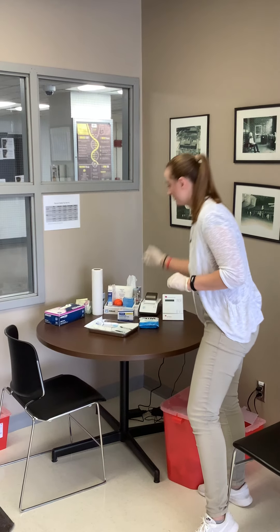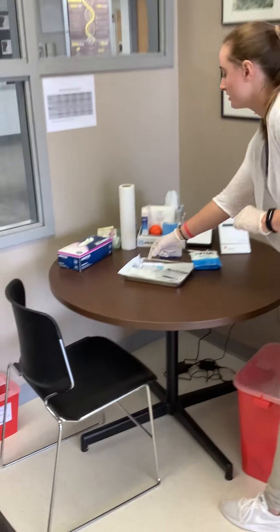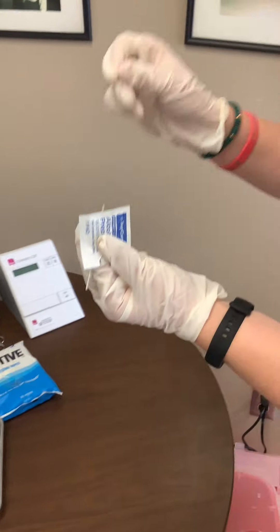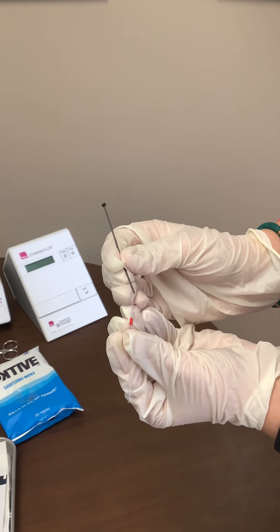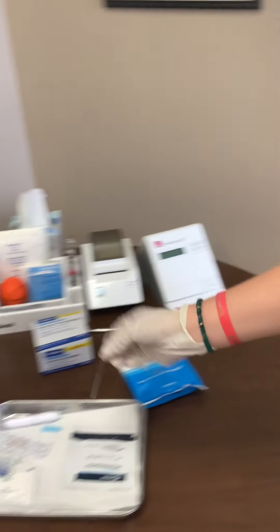When you're setting up, you're going to want to put a piece of paper towel down and then set out your gauze, an alcohol wipe, a band-aid, a capillary tube, and a plunger. Here's a capillary tube, and you're going to put the plunger in on the red side — it'll be the only side it fits in, so it's pretty self-explanatory.